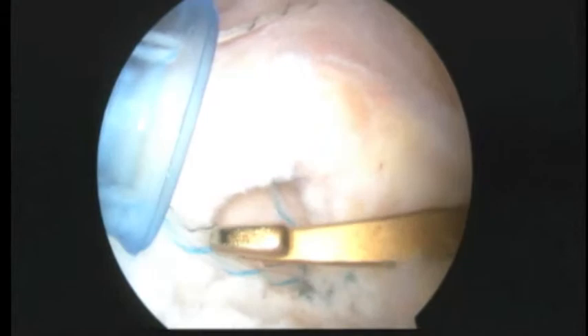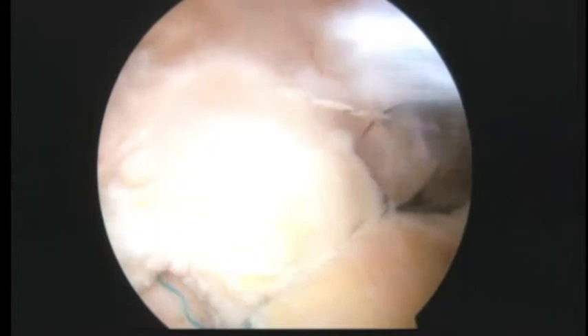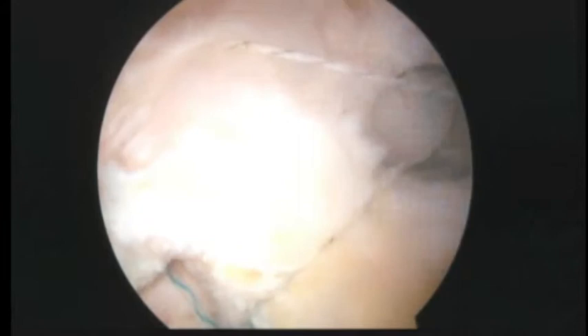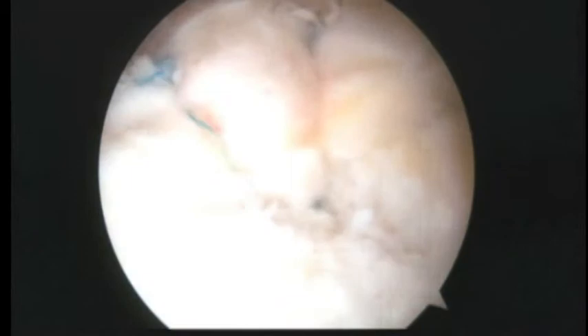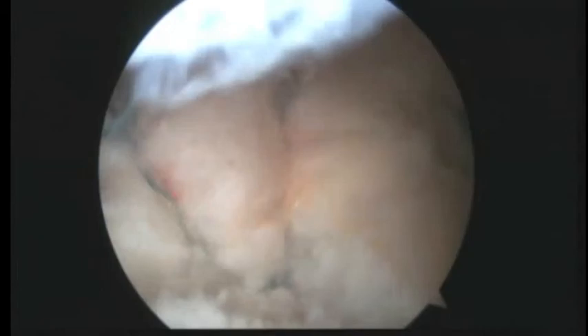We're just tying the sutures now. We've already tied the first one on the right — see that blue one that's cut — and now we're going to tie the black and white one. We've got three sutures to tie for the rotator cuff, and then we still have that one suture to tie for the biceps. We're all done. There's one stitch in the back, the central black and white stitch, and the blue and white stitch. As I rotate your shoulder you can see how that all moves together as a unit — that hole in the tendon is completely gone. We've stitched that back down to the bone. That white stitch there is for the biceps tenodesis. You've got a total of four stitches in there holding things together. I really hope that does the trick for you. Good luck to you now, bye bye.